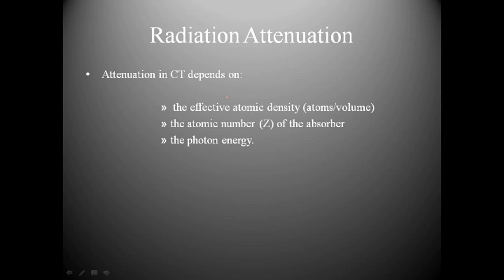The atomic number of the absorber. We all know this to be true: as you go down the periodic table and the Z number increases, you're going to have a greater amount of attenuation. We see this in daily life in radiography.